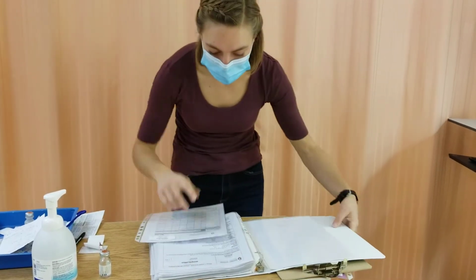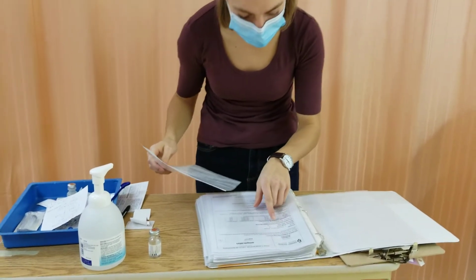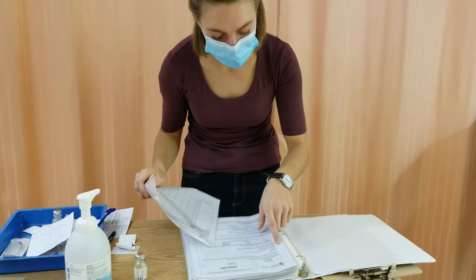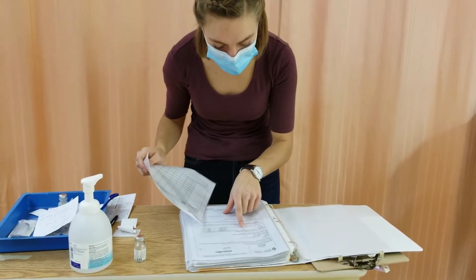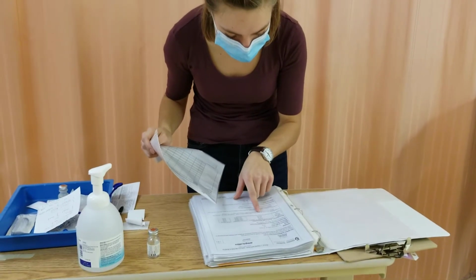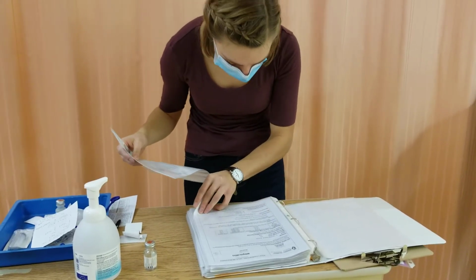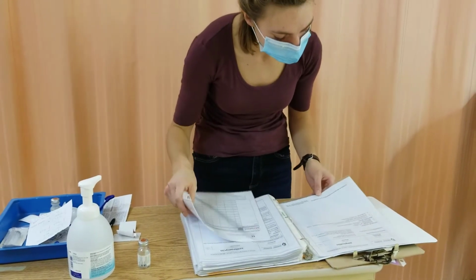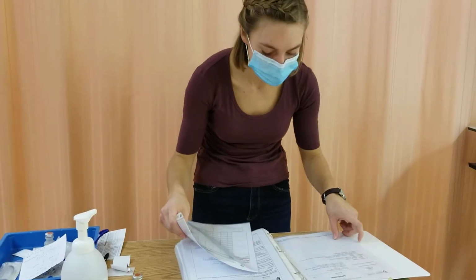So for Ampicillin, it's an antibiotic, can be given by a student nurse. The usual dose is 1 to 2 grams IV every 4 to 6 hours, and I'm within the safe dose range. Reconstitute 1 gram with 3.4 ml sterile water. Can be given with 50 ml normal saline intermittent. That's what I have here, over 10 to 15 minutes. Look at the compatibility. It's compatible with normal saline, which is running right now, and I look at the potential hazards and additional notes.